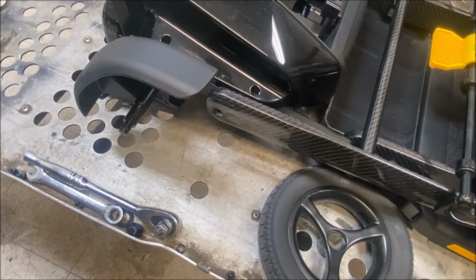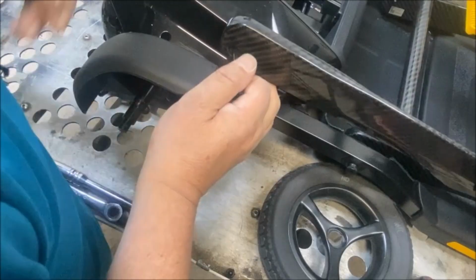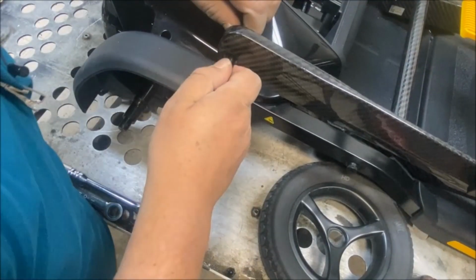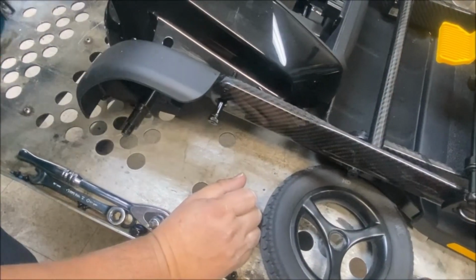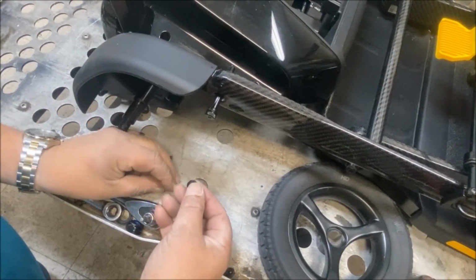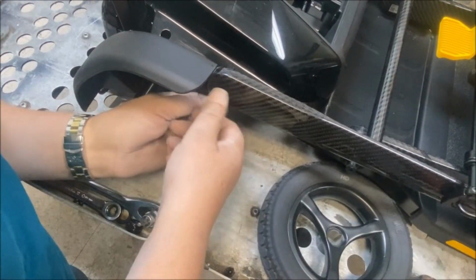Alright, so I've got my insert on the bolt already for this side, but I need it on the inside. Just there and there. And I need the inserts on the other side, on the metal part of the frame that the bolt goes through.